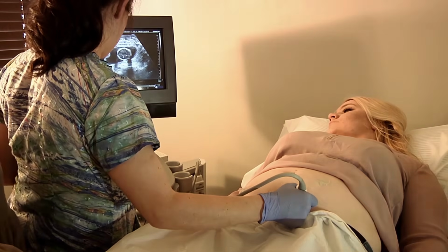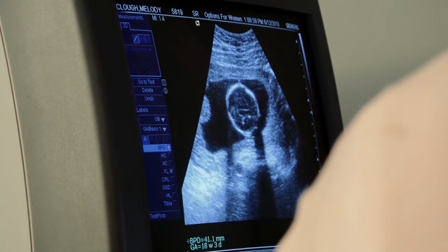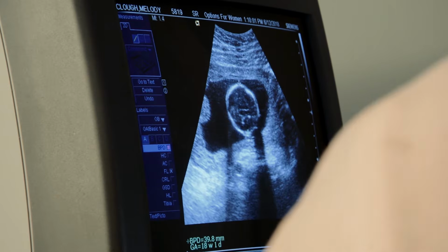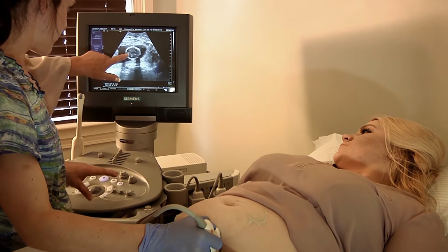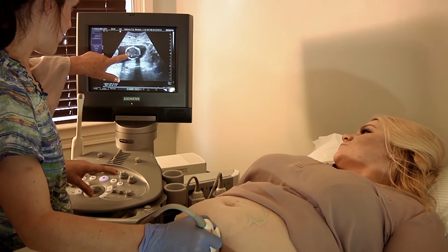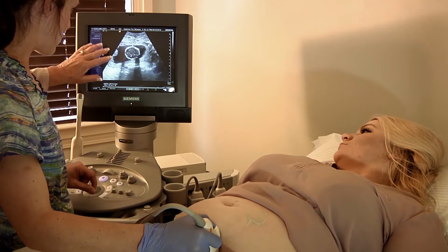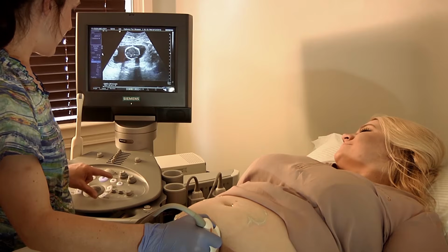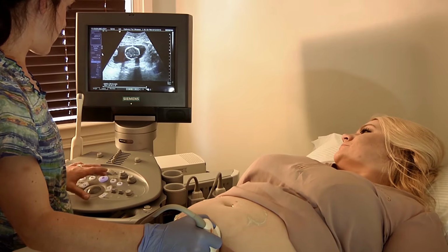Okay. Beautiful. In there. Good. Now go just a tad more. Good. Now that's good. You're 18 weeks. And these are your landmarks. You want to see the broken falx, and see this hypoechoic area in the middle is the thalamus. And you've got a nice oval shape. So this is a nice BPD. Good job. Save that one. Yep, save that.